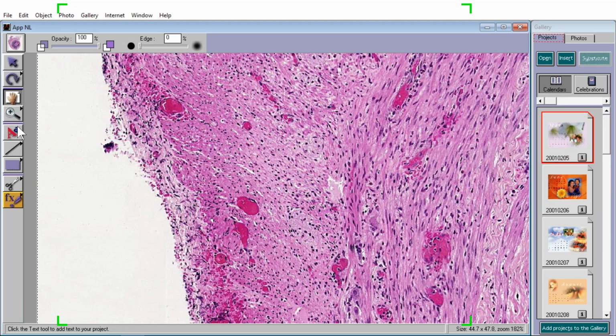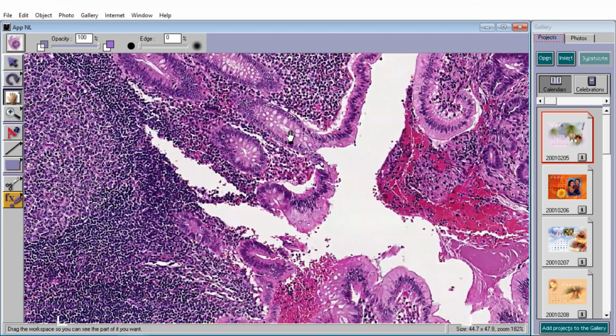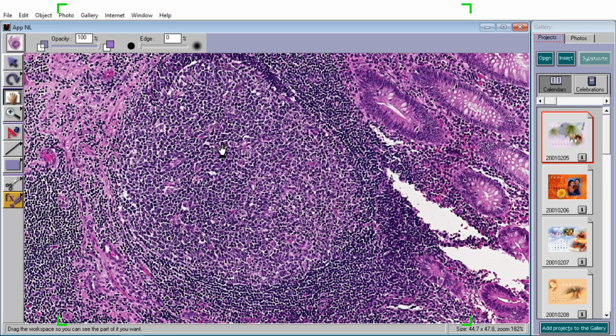And if you take the mucosa, which we're going to see over here, if that's inflamed, which by the way this one isn't, then it could be inflamed simply because of some inflammatory condition that was in the lumen of the bowel, like inflammatory bowel disease. But look, this is a nice row of columnar glands in the mucosa and a nice little collection of normal lymphocytes. In fact, you even see lymphoid follicles here. So in the appendix, usually the thickest layer is the submucosa because it's loaded with these giant lymphoid follicles. And this is not an acute inflammatory reaction.